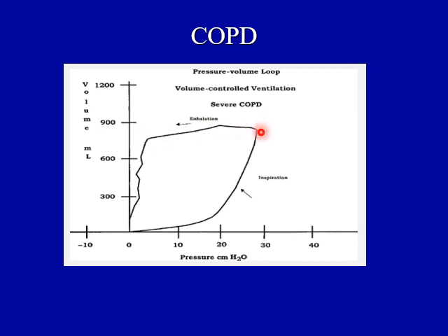When the airway pressure decreases from 30 centimeters of water to around 5 centimeters of water, the tidal volume is very small. That means there is a lot of resistance to exhalation. There are some serrations in the loop, and it is not touching the starting point; it is touching somewhere around 100 or 200 ml. So this is an open loop.